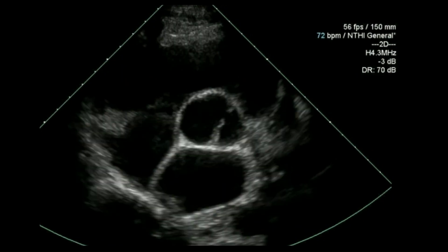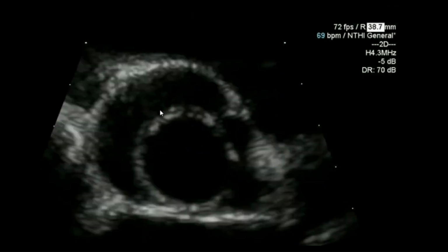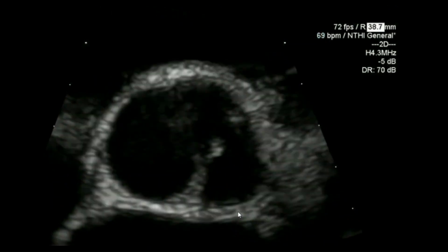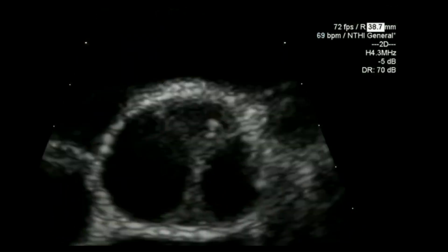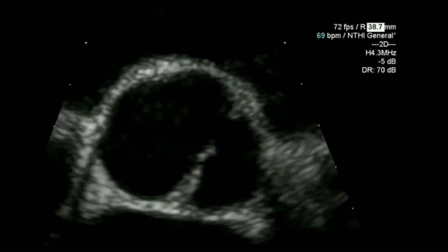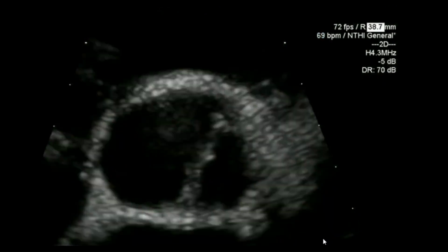You can also see, when you look a bit closer, evidence of a raphe up there and up there as well. Surprisingly, there's not a lot of calcification of this valve, and it doesn't appear that significantly restricted. However, as I said earlier, there was a marked gradient actually across this valve.